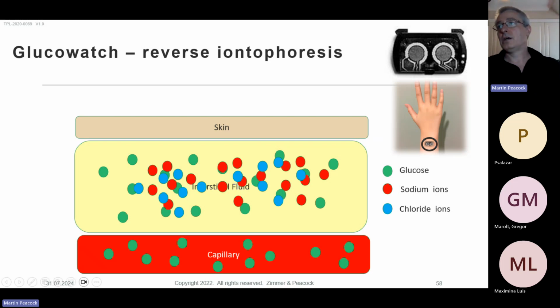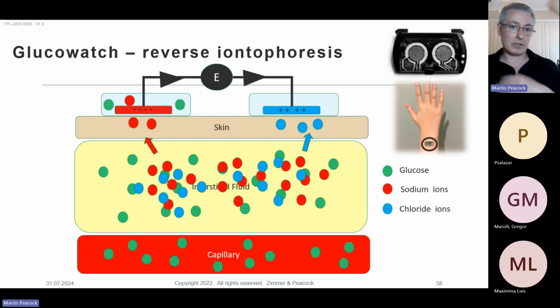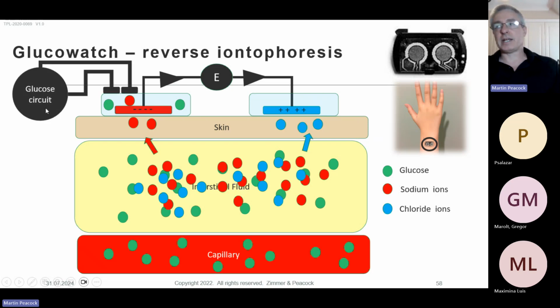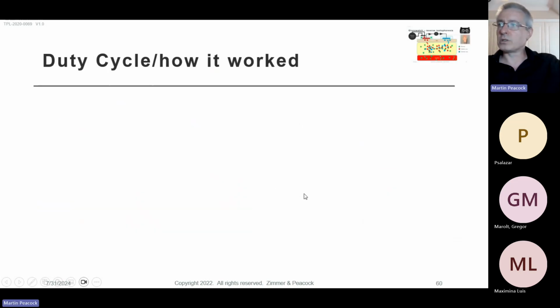Now, on the electrode patch, they were applying voltage in order to have a current. But you don't pass electrons through the skin. If you're passing a current through an external circuit, you're going to end up having to shift ions, and those ions will probably be, for the bulk, sodium and chloride. Sodium and chloride are probably dragging water with them, and by dragging water, you're also dragging glucose with it. So I suspect that they had two circuits on this. A circuit for the reverse iontophoresis, because that's going to have to apply quite a large voltage and carry quite high current, and then a glucose circuit, which is actually measuring the glucose itself. They were a generation one glucose sensor. This is not the webinar for talking about generation one glucose sensors quite a bit.